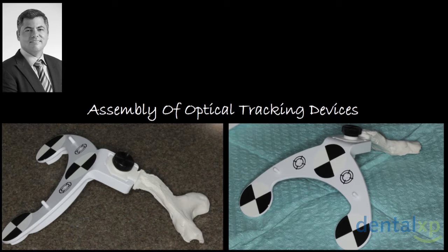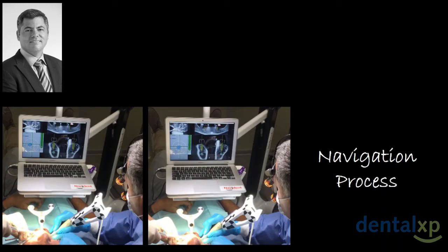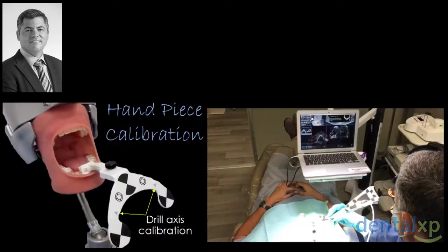This is what is called the optical tracking devices. This is the one that goes in the mouth and it's going to have some black and white marks. And these are other devices that are utilized basically for calibration, the assembly of the handpiece. And I have the tendency of using cheap tape. There is a specialized tape that should be used. I always forget to get it and I grab what I find first. It works. And you go into the navigation process.